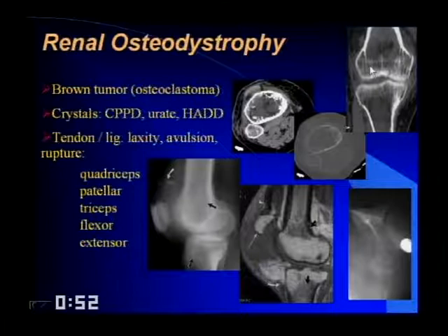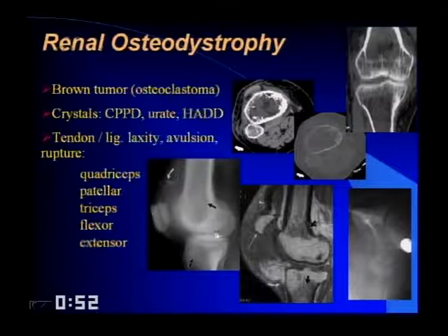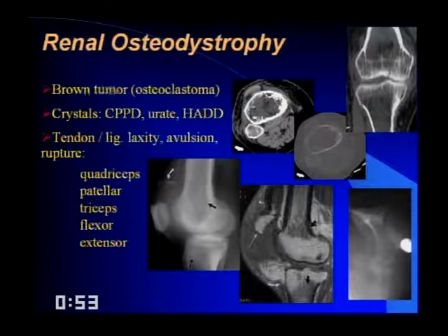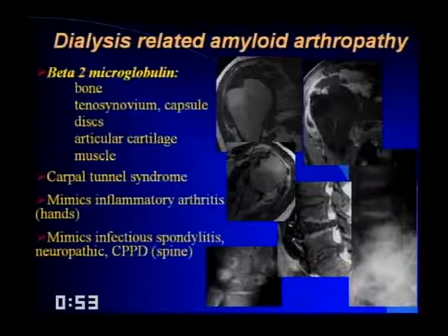Brown tumors can occur anywhere and may be mistaken for metastatic disease. In patients on long-term dialysis, deposition of beta-2 microglobulin causes dialysis-related amyloid arthropathy, which can simulate an aggressive process like neuropathic joint or infection. Amyloid deposits in joint capsules, discs, articular cartilage, bone, and muscle. Here's a man in his 30s on long-term dialysis: all the material in his shoulder is amyloid, with the rotator cuff affected as well. Pressure erosions are visible on axial images.